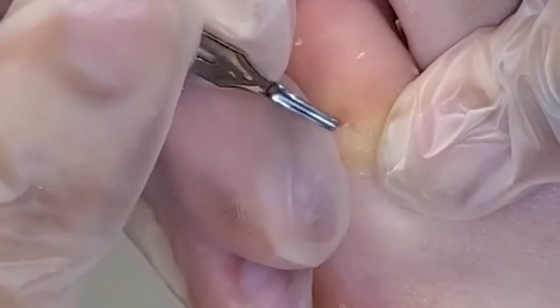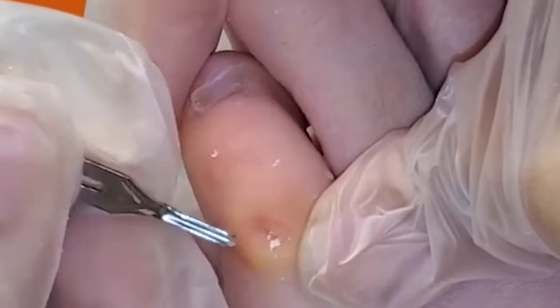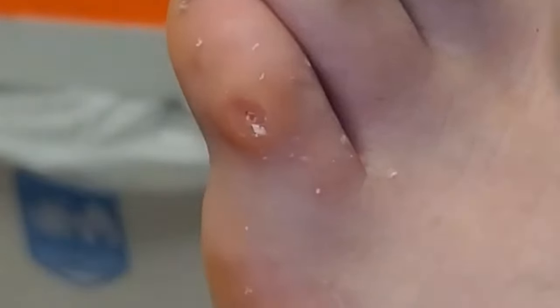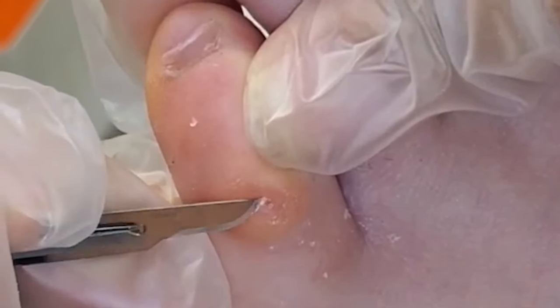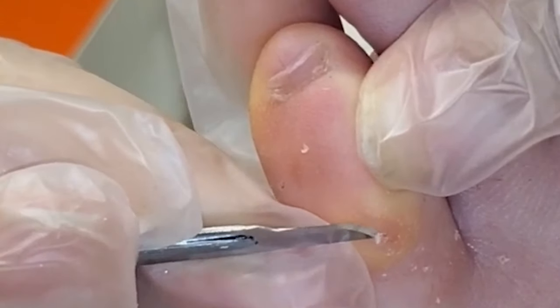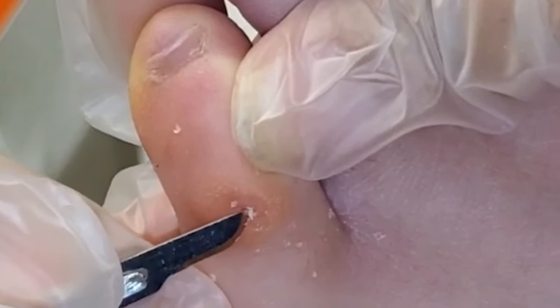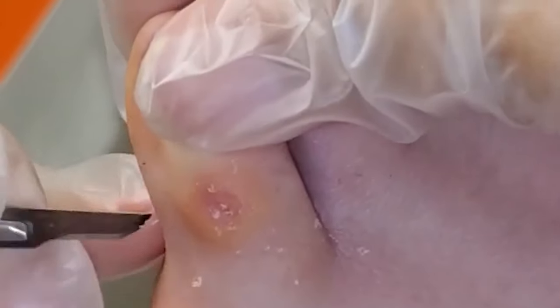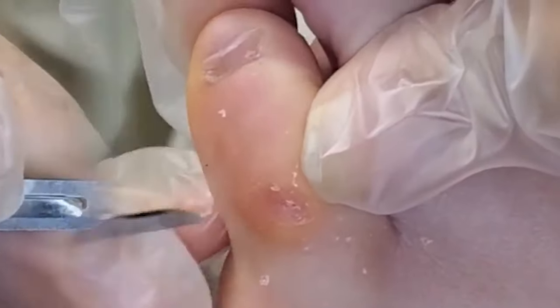With a bit more pressure — sorry. In Panama you can't do anything without a car. I don't have a license, I'm just walking around. Is it way deeper than the other one? Yeah. I'm just literally taking my time. I bet people get really annoyed with me taking my time, like 'come on, just take it out Marion,' and I'm like, it's not my fault it just doesn't want to come out in one piece. England is really convenient — I could walk home in four hours if I wanted to, enjoy the River Thames view.